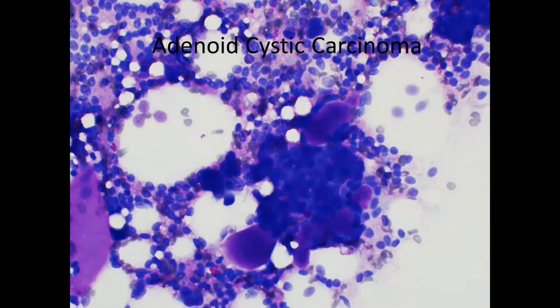In adenoid cystic carcinoma, really we're dealing with a much more monotonous population of cells, and these cells are basaloid. Basaloid meaning that even though this is a high-grade tumor, the tumor cells are very bland and monotonous. So if you look at the cell-per-cell level, this does not look like a malignant tumor necessarily. Again, it's very bland, monotonous cells with high N/C ratios, but a very uniform cell population, and it's entirely comprised of these basaloid cells.